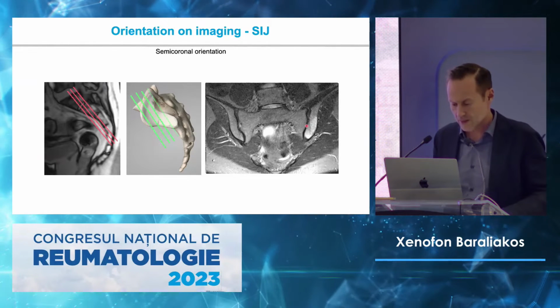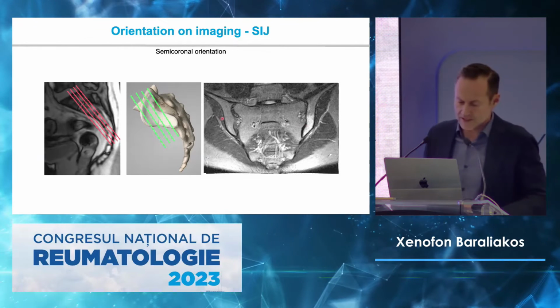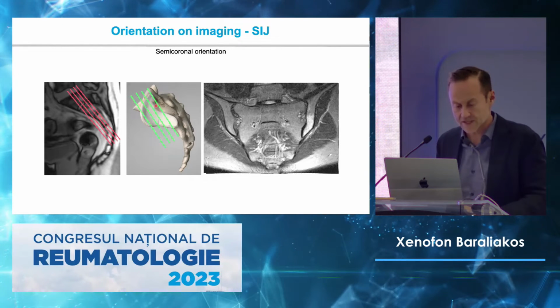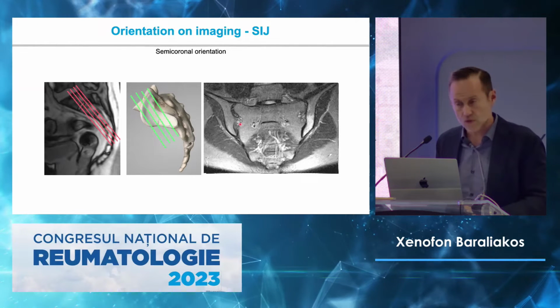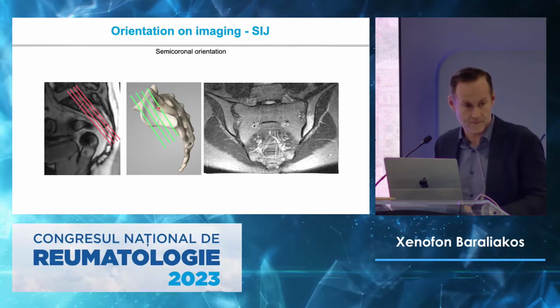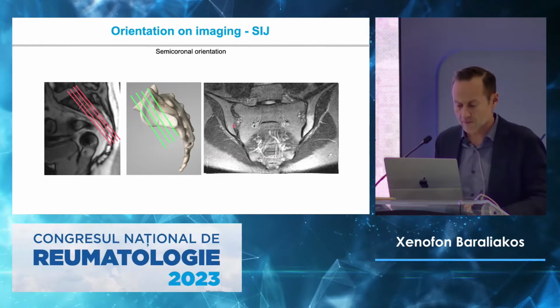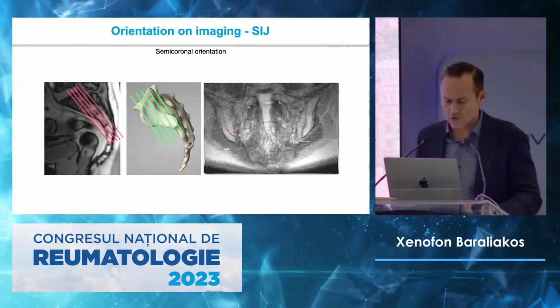the cartilage is. One important thing to take into account is that there is a point where the sacrum has its curvature here, so it misses some cartilage. This is that part, which is not an erosion. This is where the ligaments come in. So this is a normal S-shaped sacrum. The iliac bone doesn't have that. And then we go further to the back.